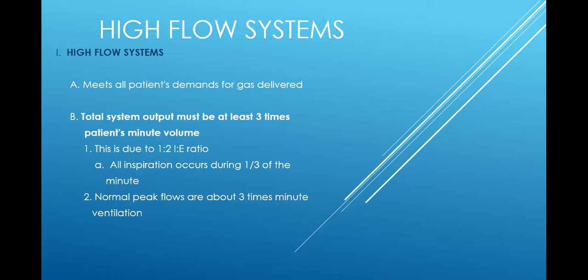Okay, when you get to a machine, a ventilator or a BiPAP or a CPAP, increase the flow. That's what he's telling you he needs. Come on with that flow. Feed me too slow, like a baby, a fat baby, you trying to give him little bitty bites at a time. He's looking at you like, come on with that. It's the same food, but you need to bring it a little quicker, okay? And so that's what we have to know.